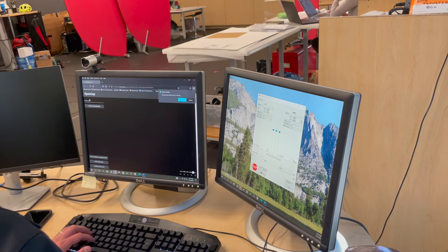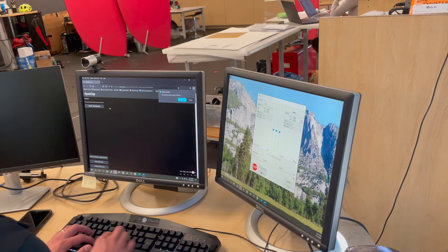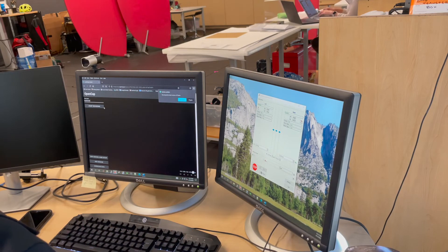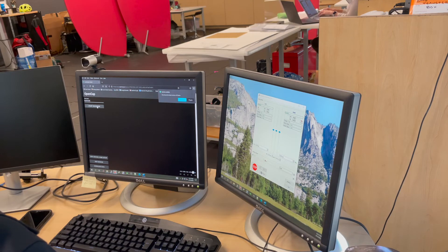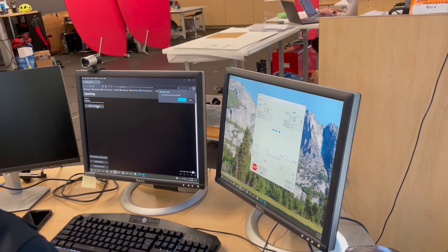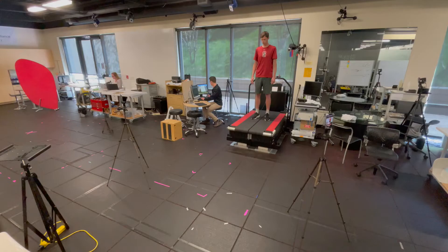If your setup allows, you will get the best kinematics by having the participant walk towards the cameras so that it can see their feet and arms at all times.